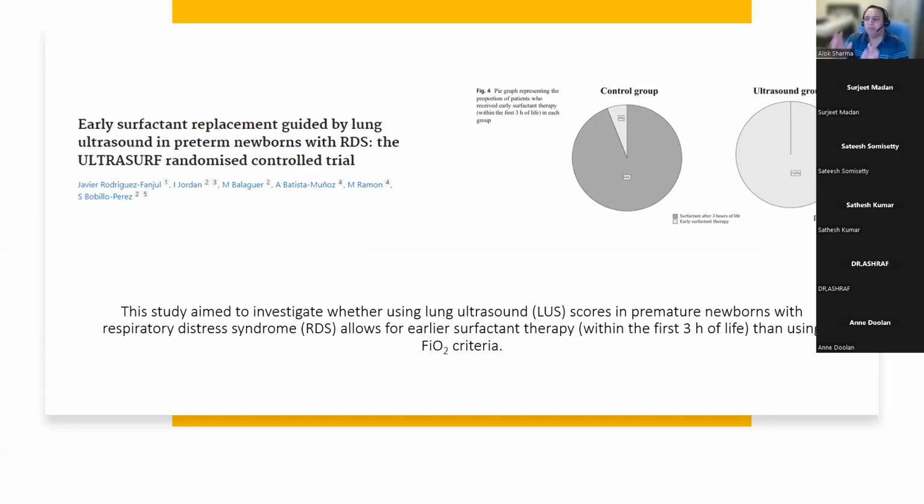Now, for people who use anterolateral areas to determine the lung ultrasound scores and diagnose RDS, their argument is that the back's only going to be worse, as Dr. Ashraf is pointing out, because it's dependent, and really you're going to have a lot of interstitial edema at the back. So they argue against the point of why do the back? The handling is unnecessary. You get the information.